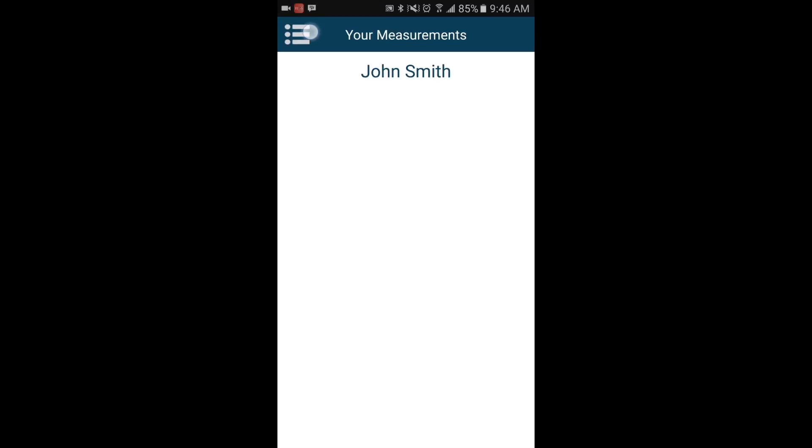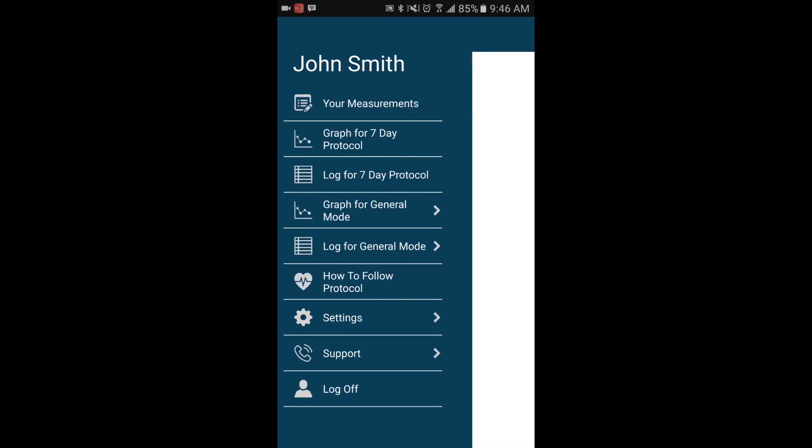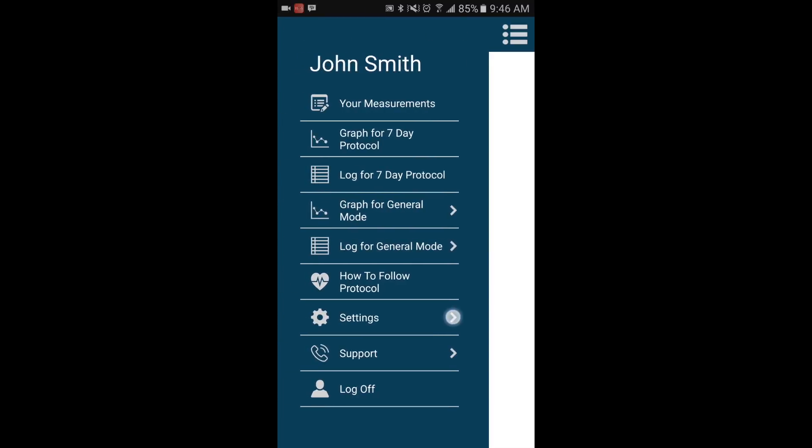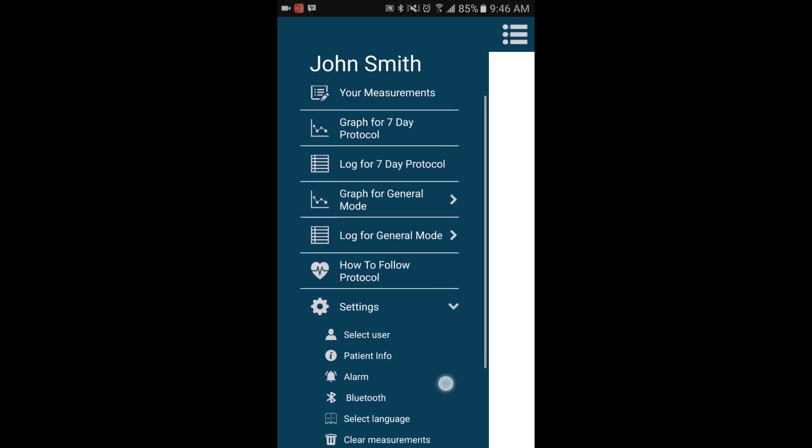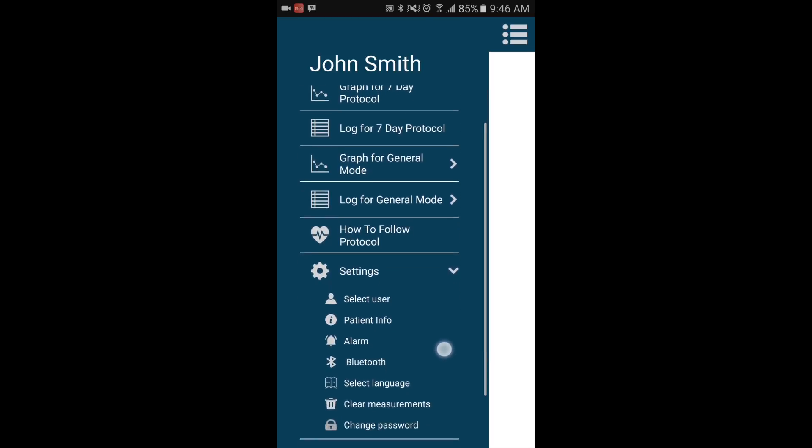Once the Bluetooth settings on your device are on, you will need to go into Settings and then Bluetooth.